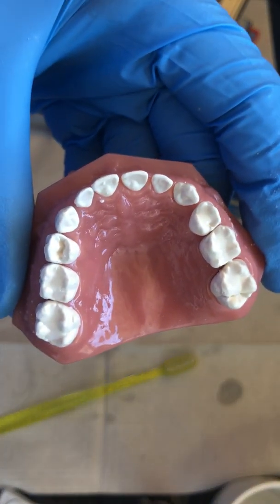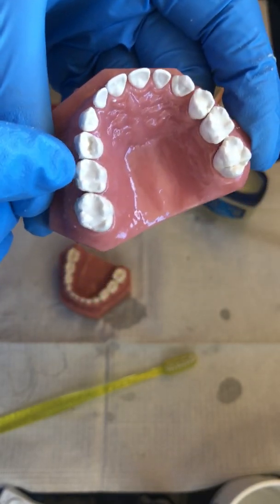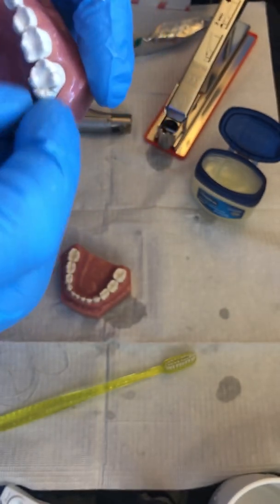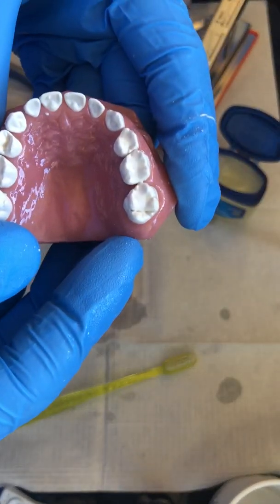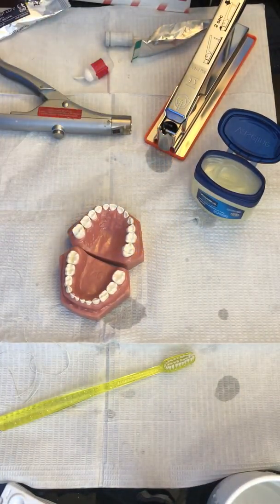Here you can see that we did not seal this one tooth, but we got a pretty darn good sealant on that tooth, that tooth, that tooth, that tooth, and that tooth — so five at once. Oh man, you see that distal groove? We missed it. We'll have to do another one for these two teeth. Pretty easy though.